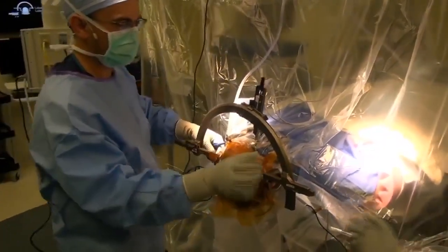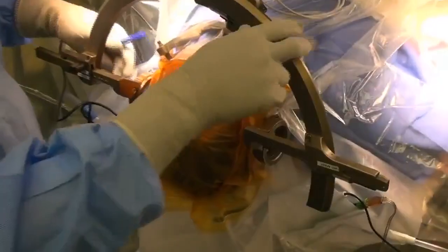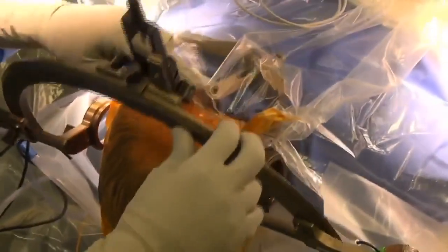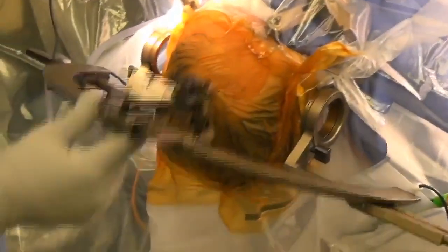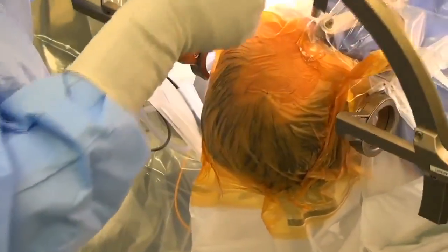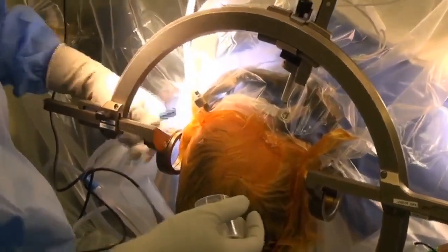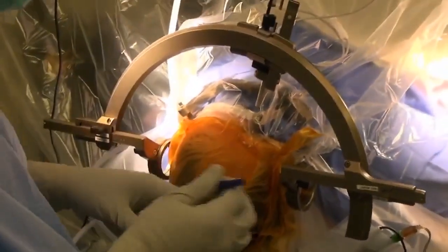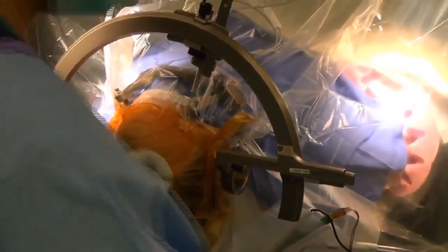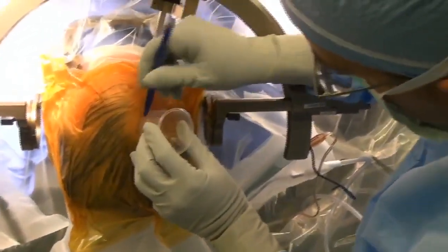All right, so you can see here again, the whole principle behind this frame, aside from squeaking, is that no matter where this is positioned, it's going to be pointing to the target. So we can slide this thing back and forth, we can slide it up and down, but it's always going to be pointing at our target. So the only coordinates that we're dealing with now determine the trajectory.